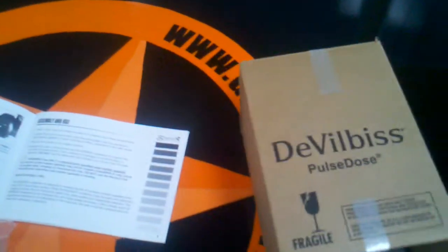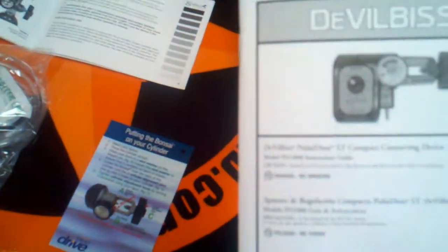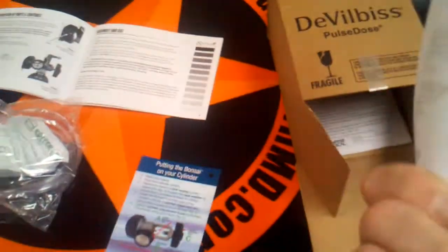It comes in a fairly small box and then it has information in there, the warranty card, and this product does have a five year warranty.